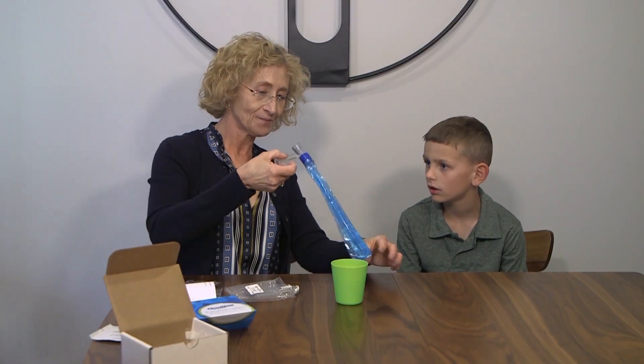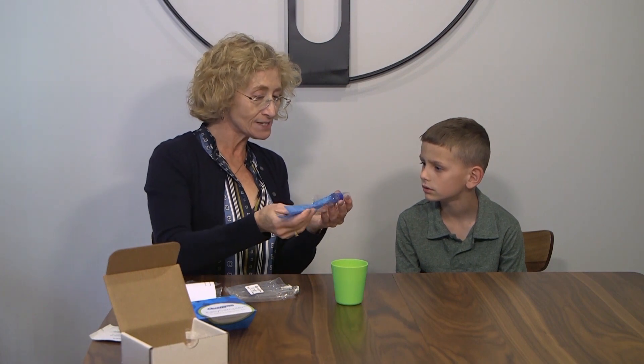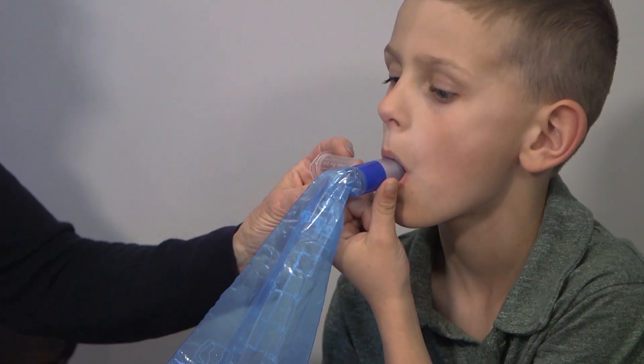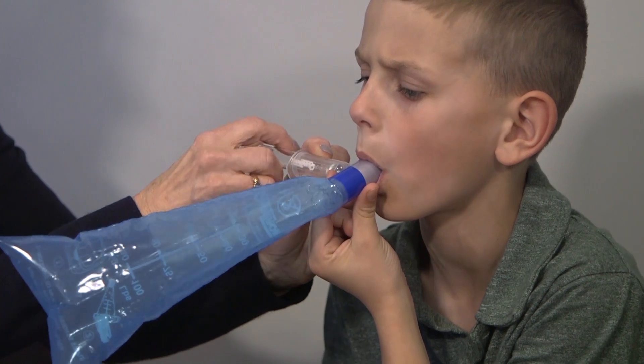The kit comes with four test tubes and we would label all of these — one, two, three, four — with the name and the date. First of all, we are going to get a baseline breath sample. There is a little bag here where we collect the breath samples. You shouldn't put your fingers in there. We want you to blow around this end of the device and keep your lips on there tight. You're going to blow into this and keep blowing while I get the sample of breath. Place the mouthpiece in your mouth with your lips around it, then start blowing and keep a continuous breath going while I put the tube in and out. So we have our baseline breath sample, and now Conley would drink his solution.